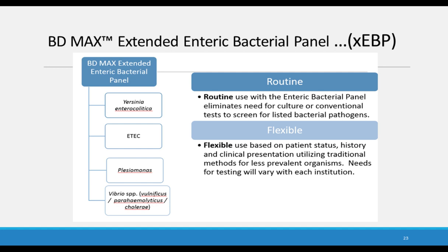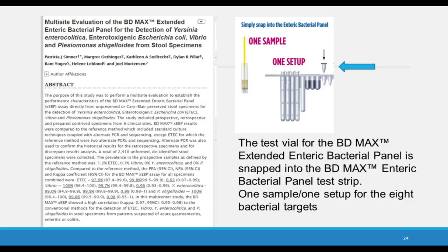Or perhaps you could be a little bit more flexible in your usage. This is the way we went in our laboratory. We did not think that we needed to test these pathogens on all of our stool, and we educated our clinicians and have given them the opportunity to add this on to their order, but we do not routinely do it on every specimen. We think that testing for these unique pathogens should somewhat be based on the patient status, the history, and clinical presentation, rather than just testing every stool specimen. But of course, this will vary with each institution, and you need to make the decision if this should be an extra add-on or if you want to do it routinely on all stools.